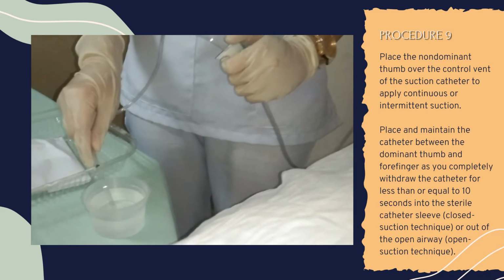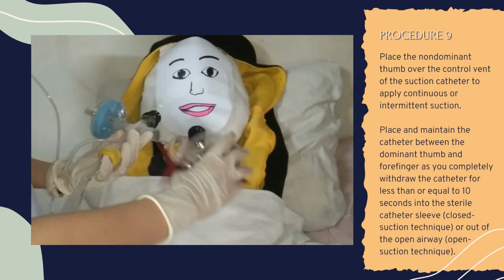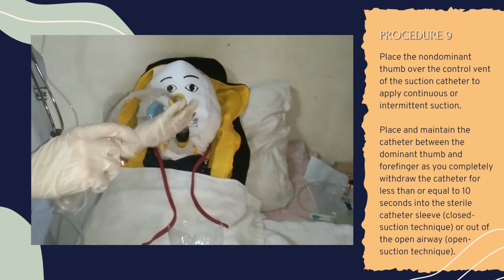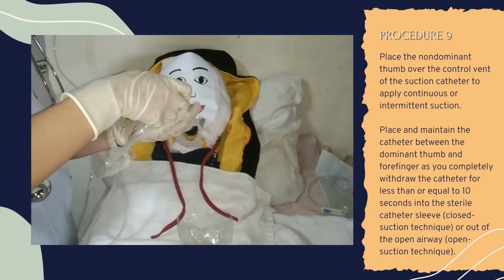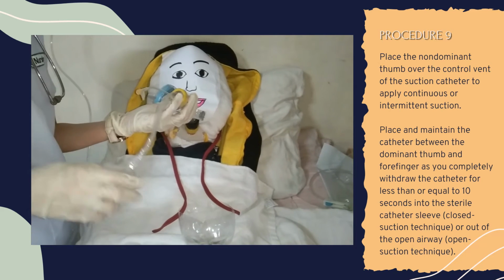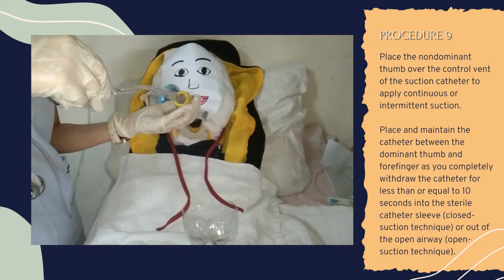Place the non-dominant thumb over the control vent of the suction catheter to apply continuous or intermittent suction. In closed suction technique, place and maintain the catheter between the dominant thumb and forefinger as you completely withdraw the catheter for less than or equal to 10 seconds into the sterile catheter sleeve. This decreases arterial oxygen levels during suctioning, so it must be kept to a minimum with brief suction periods.